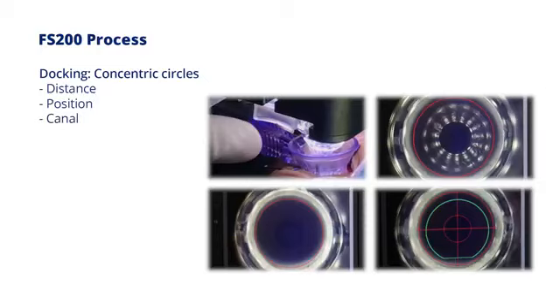The right upper picture shows the docking concentric circles pattern of the suction ring, red circle, limbus and cornea, and the pupil in alignment.